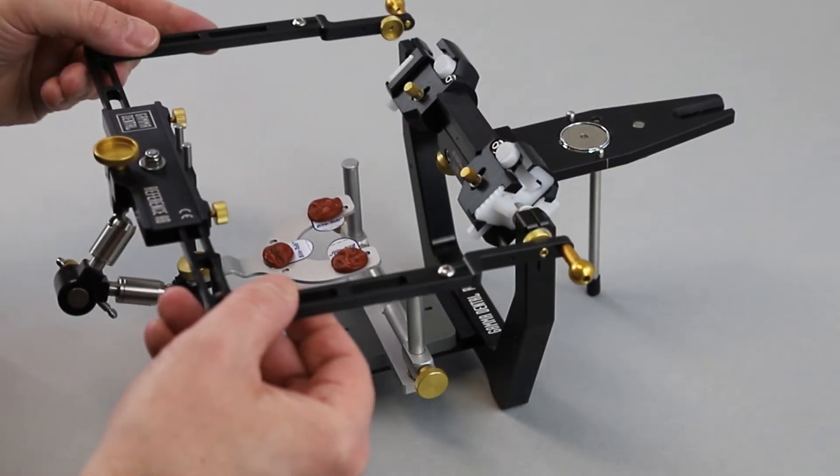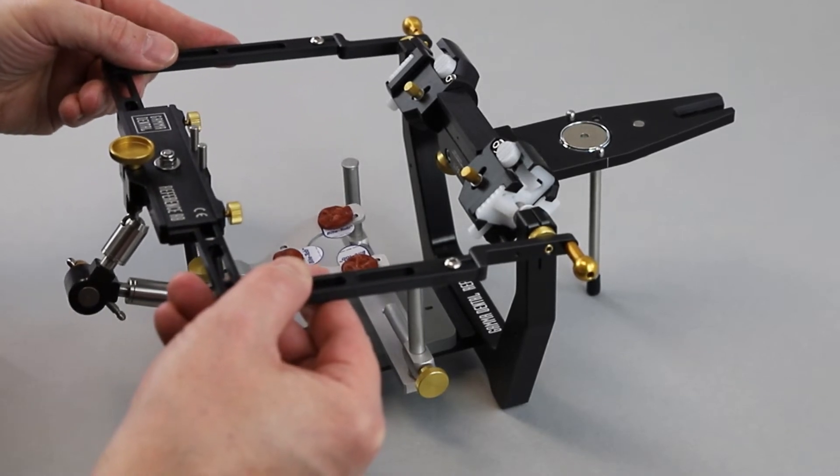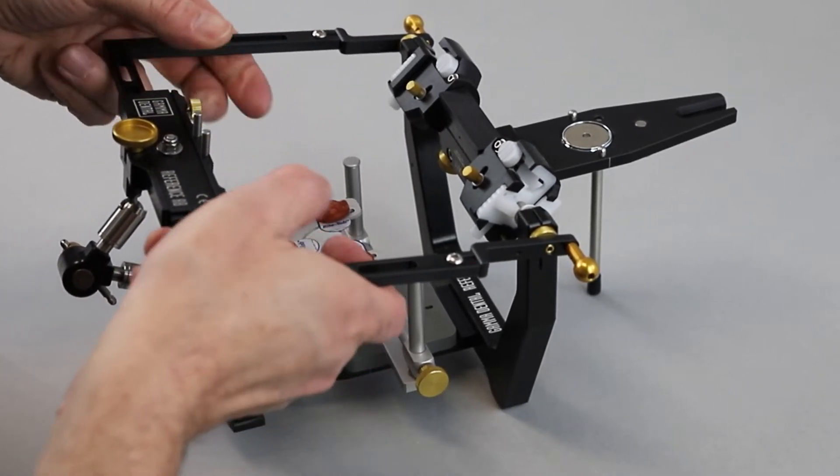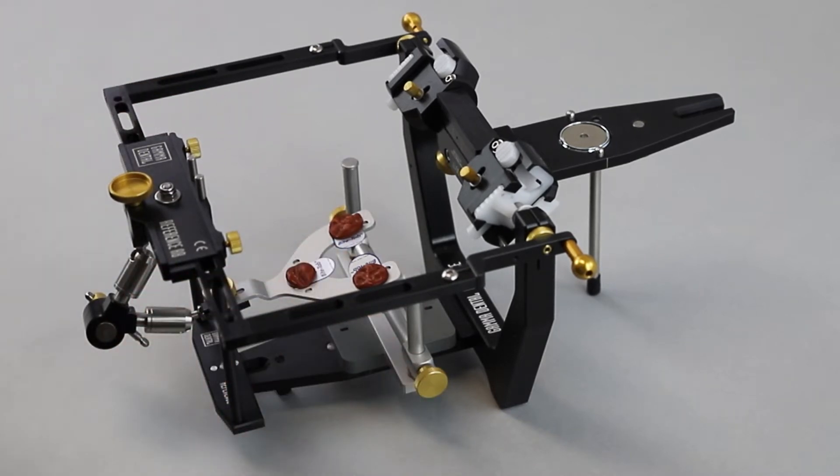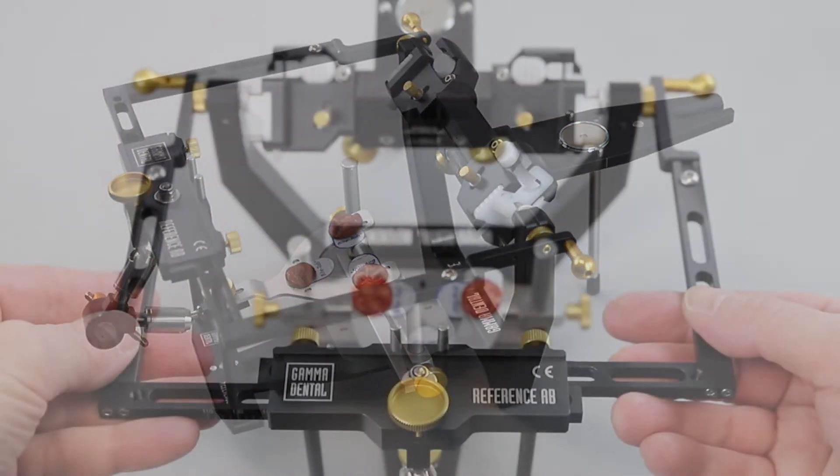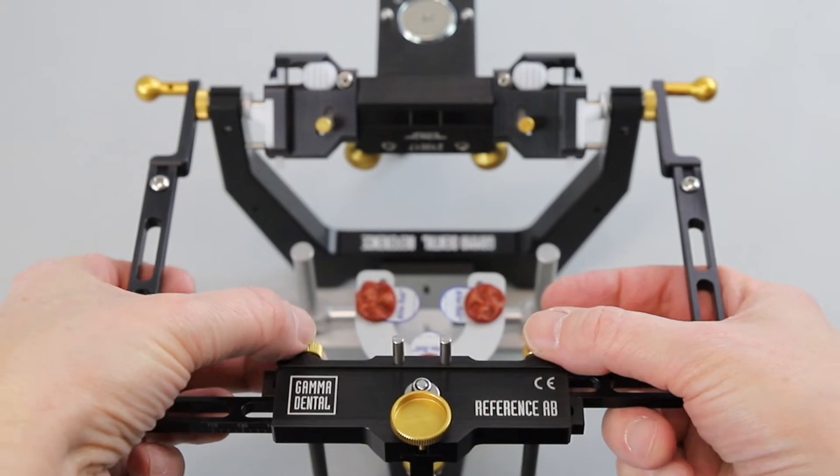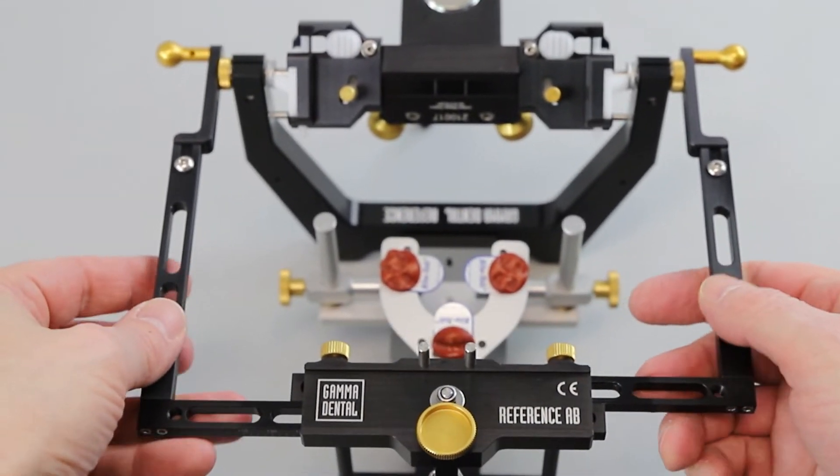The adapter plates can now be inserted to the corresponding casings. To do so, the reference AB face bow is pushed together gently but firmly until both guides slide firmly in place. Next, the face bow is placed on the face bow support and the anterior bow fixing screw is tightened, thus locking the bow.